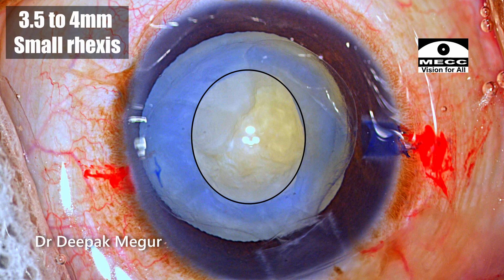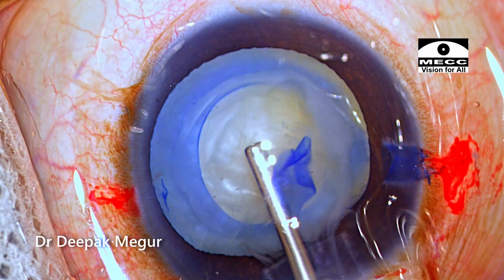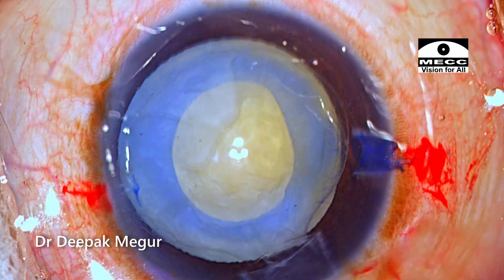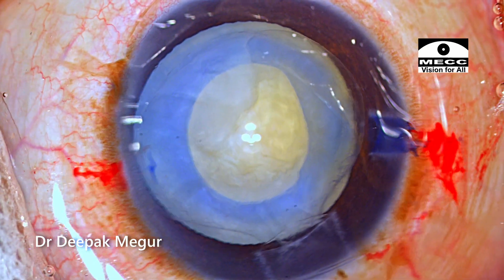At this point, I was thinking it's not too small. So let me perform phaco through this rhexis itself and then enlarge the rhexis after the emulsification of the nucleus. So that was my plan.